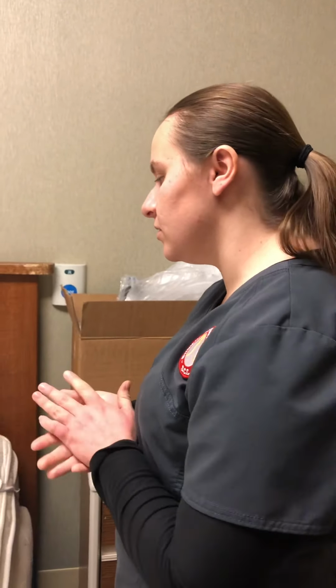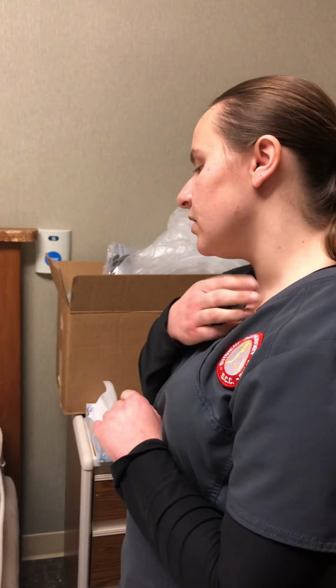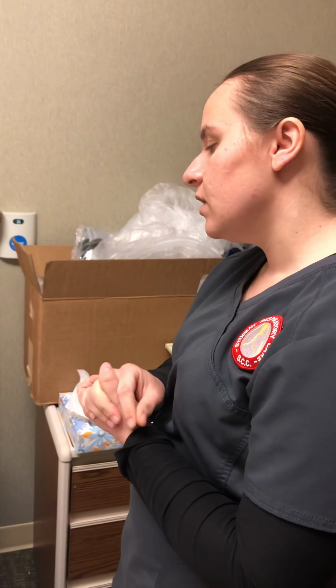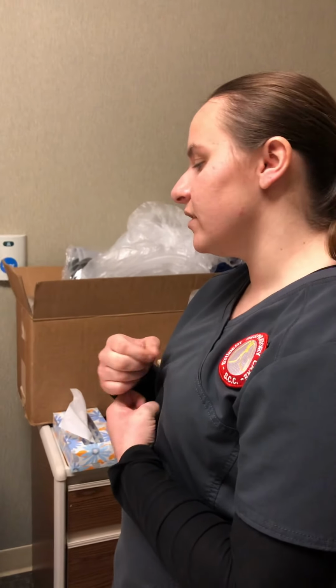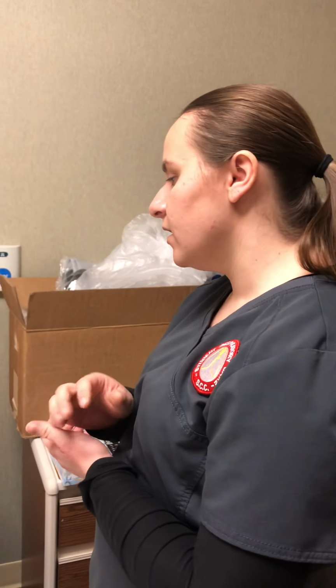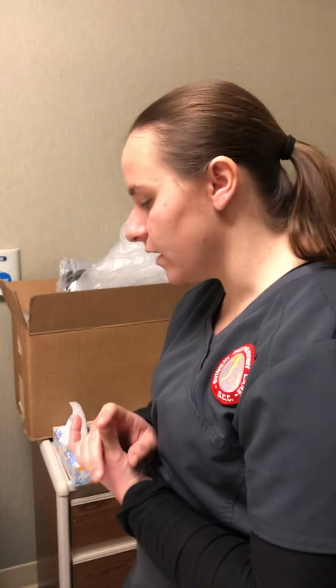All right, so good morning, Mr. Johnson. I'm going to do what's called a trach care. And so this is just, I'm going to clean around your tracheostomy here, the trach here. So it's just a tracheostomy care kit that I'll have with me, and I will clean everything. That way we don't cause any infections, and I'll clear out any excess secretions that you may have. That way it'll be a little easier for you to get that air down into your lungs.